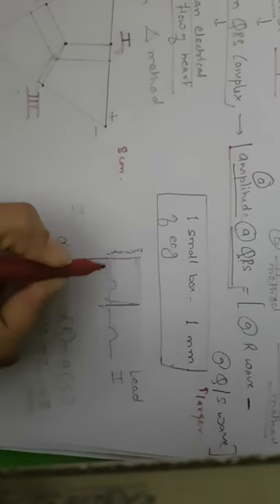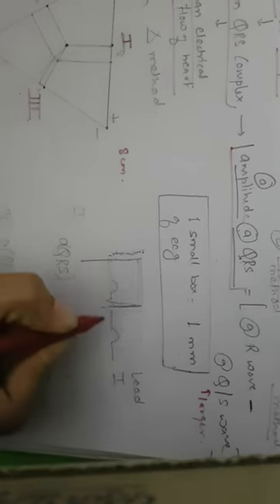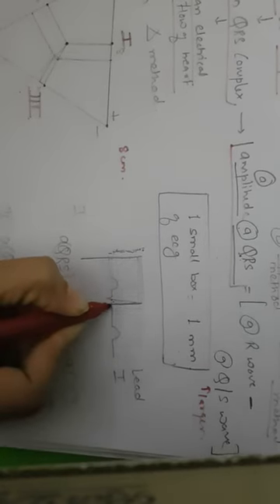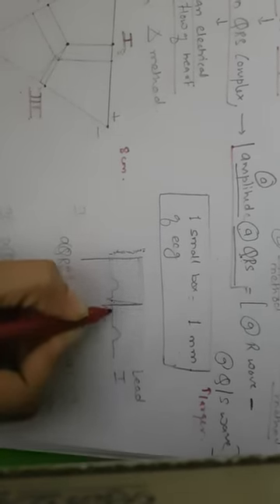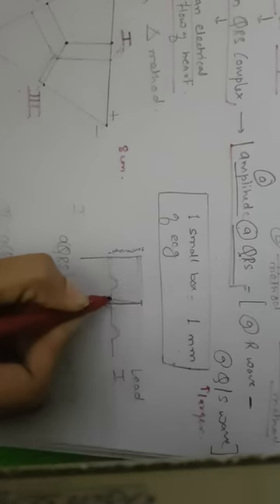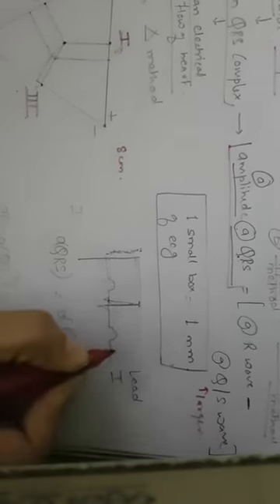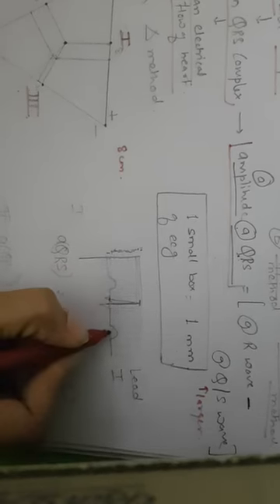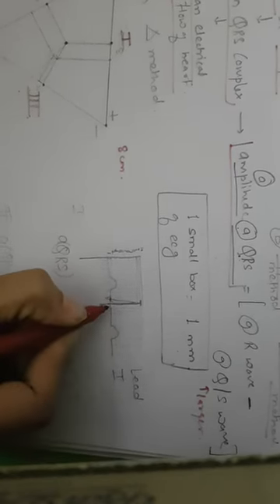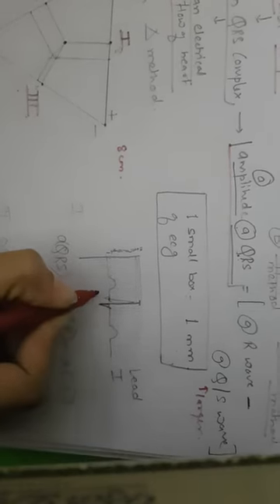Now if you see the ECG, there are small boxes. One small box is equal to 1 mm. So this is the baseline. If you find out the number of boxes in R wave, from here to here, there are 10. So amplitude of R wave is 10. Now here the big negative wave, which wave is this?